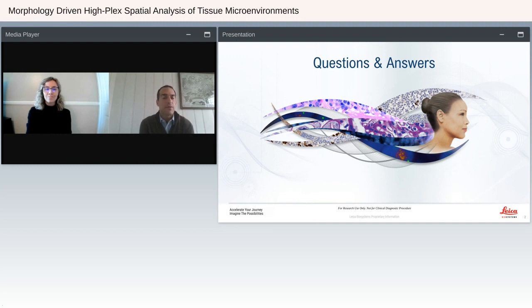With profiling, the way we do it with our oligo tags, we can go up to whole transcriptome and beyond. Theoretically, there's no limit to the number of plex that we can do. So between profiling and imaging, profilers are usually at the whole transcriptome level or beyond, while imagers are usually more targeted, even if it's a high-plex multiplex imaging assay. And then the quantitative aspect, higher throughput, and more quantitative, are usually the big differentiators between a profiler and an imager.